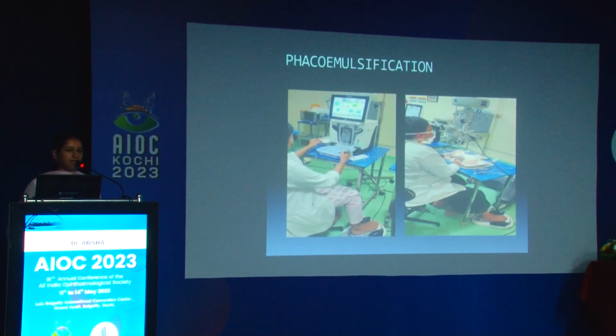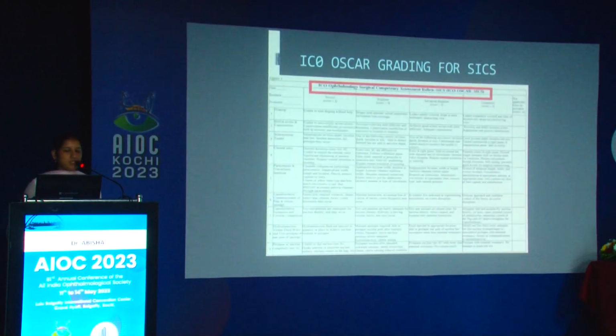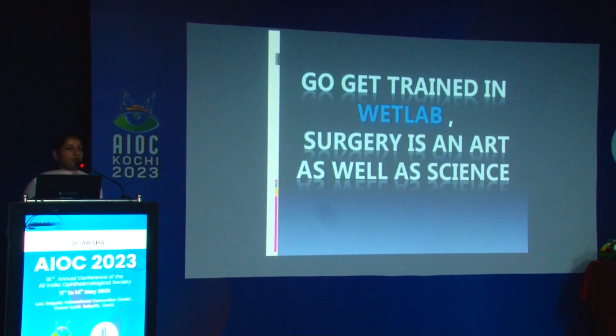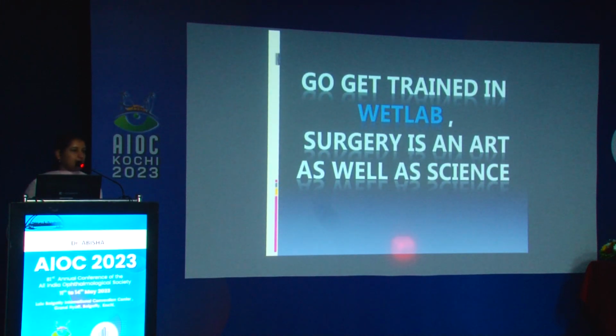Coming to phacoemulsification wet lab, for the phaco dynamics as well as foot pedal adjustment, we can get well trained in the wet lab. And we should maintain a logbook to assess the progression. And we can follow ICO-OSCAR grading for SICS, which will be dealt with in detail later. So all residents, go get trained in the wet lab. Surgery is an art as well as a learned science. Thank you.